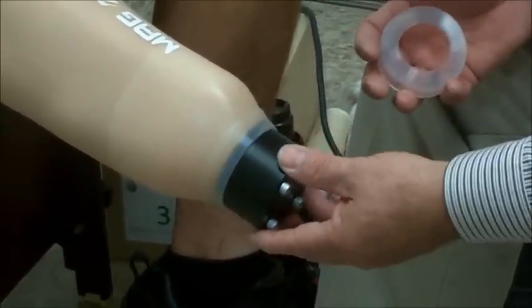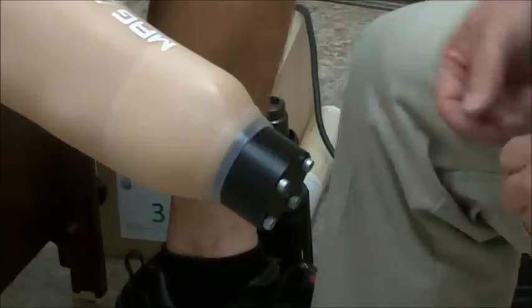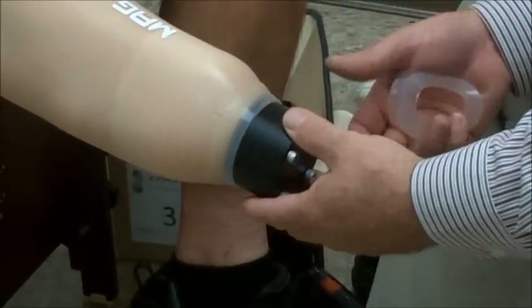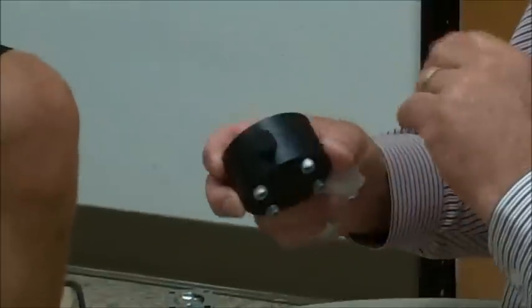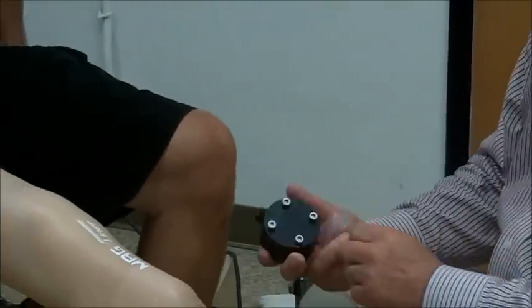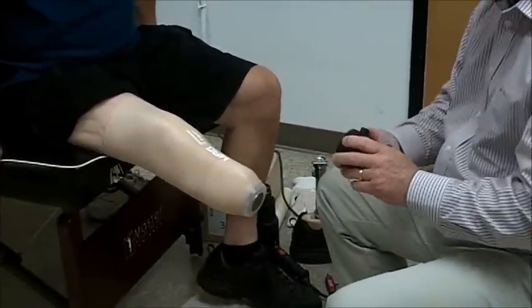This MagLock dummy also allows me to work on my alignment to make sure that I am pretty close to where I want to be. If I'm not, I'll push the liner a little bit just to get me in the ballpark. There's also a little crate dummy on the side, so when you get the cast done you can cut around here, pull that out, and everything slides out. I've added four little screws so that I know where my screws are going to be when I mount this.